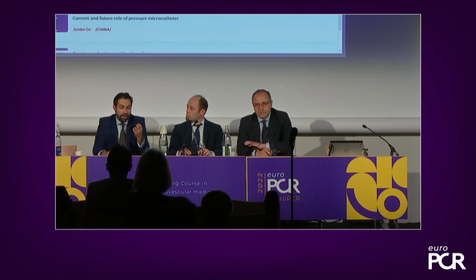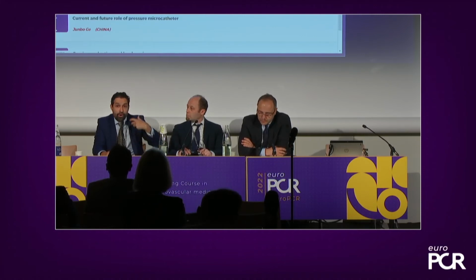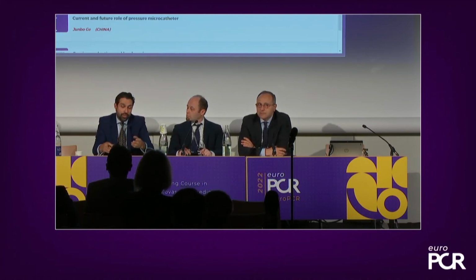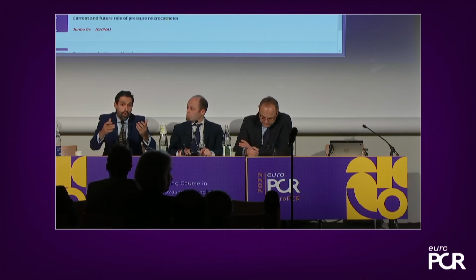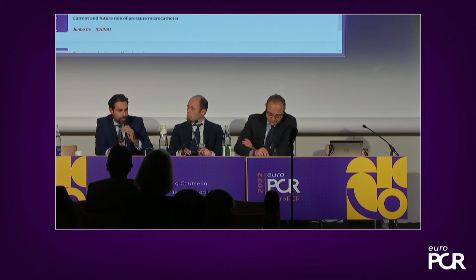So you have eliminated one stenosis, the flow has increased through the vessel, and it unmasked a second stenosis that was not visible because of the reduced flow when the first lesion was present. And this is one of the reasons why I think repeating the hyperemic functional assessment is very important to understand the degree of functional revascularization that we have achieved.